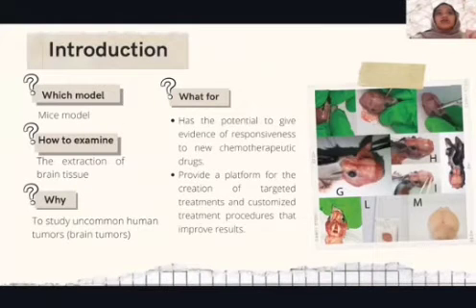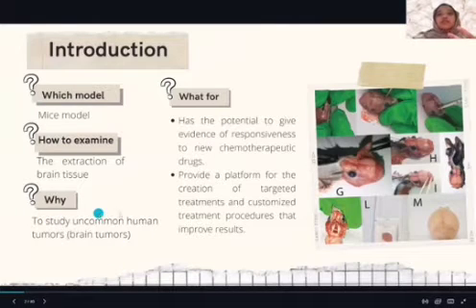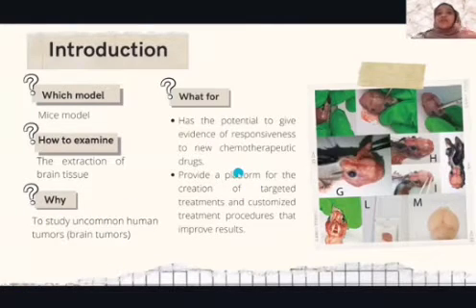Our group has chosen the mouse as our model for our project, for the extraction of brain tissue for histological examination. Mouse models have become more important in the study of uncommon human tumors in recent years, especially brain tumors. The application of biopsy methods in a preclinical environment has the potential to give evidence of responsiveness to new chemotherapeutic drugs in treating brain tumors.